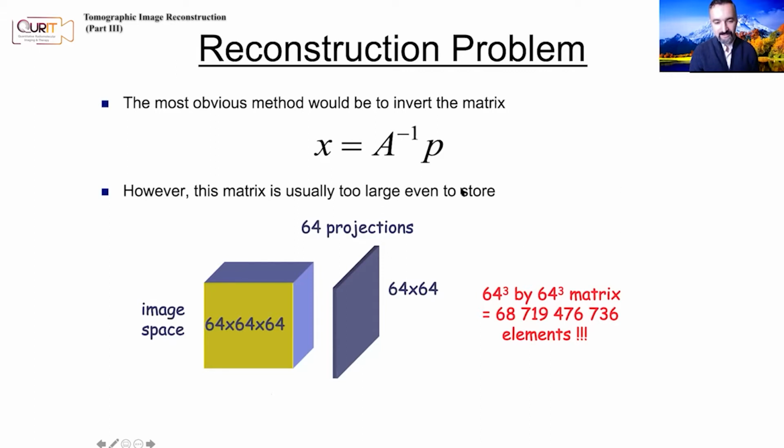I remember that even in the 2D, where it used to be like 128 square by 128 square, I remember there was a time where MATLAB couldn't handle that. Now, of course, you can do more and more, but the point is these are massive numbers to store, right? That's problem number one. So in practice, people look for another approach.